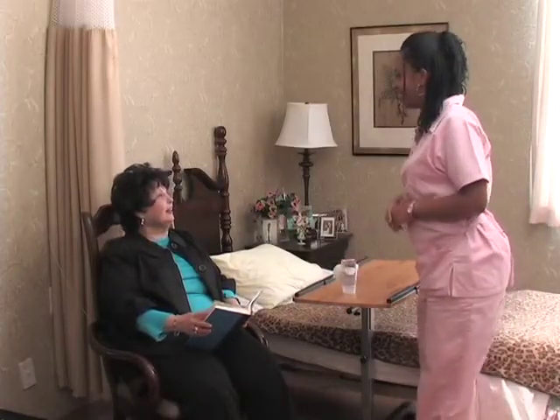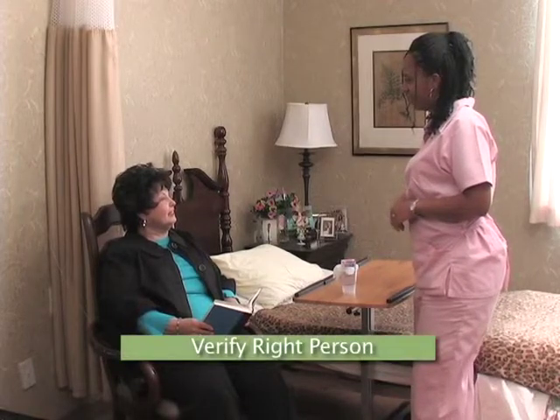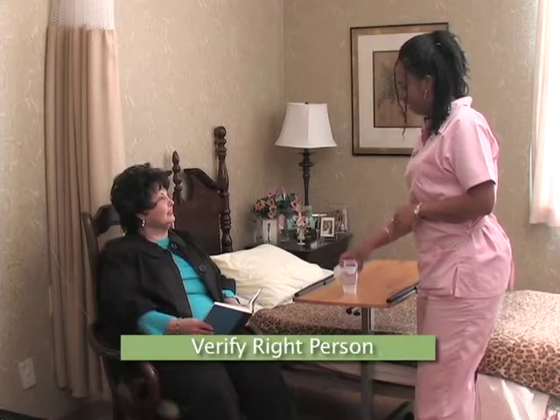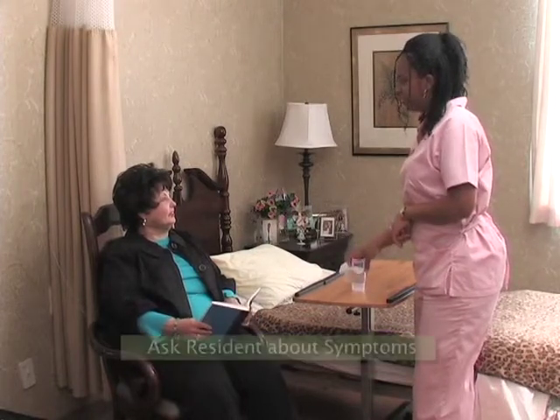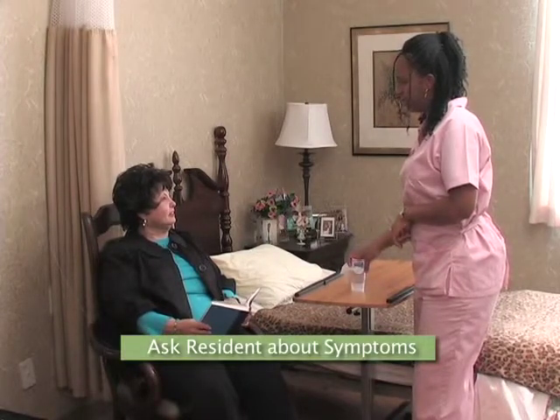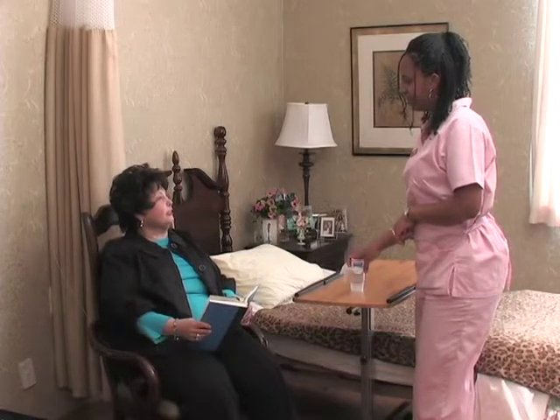Hello, Joanne. Hi. How are you today? I'm fine, thank you. Can you verify your last name for me? Yes, it's Casa. Okay. I have your inhaler for you. I noticed you were walking earlier. Did you have any shortness of breath? A little, but it's much better than it used to be.